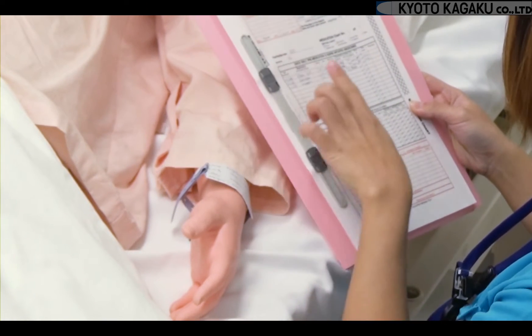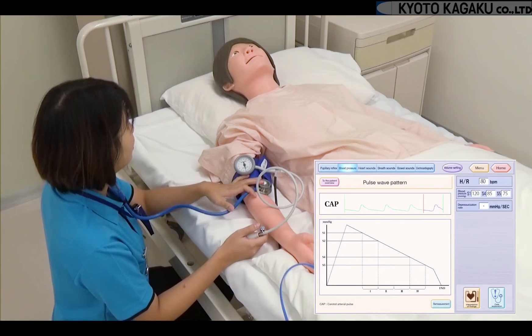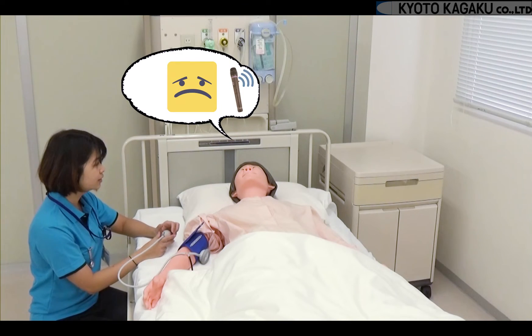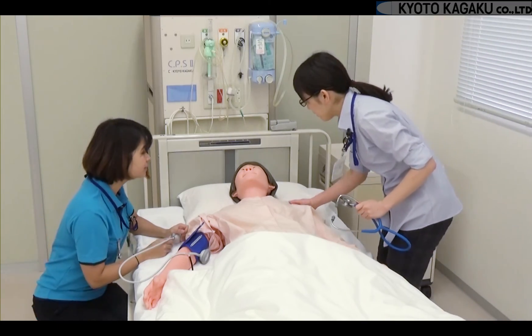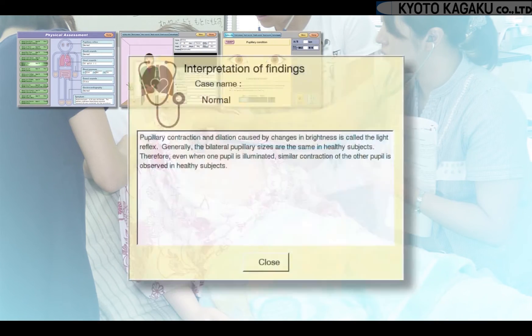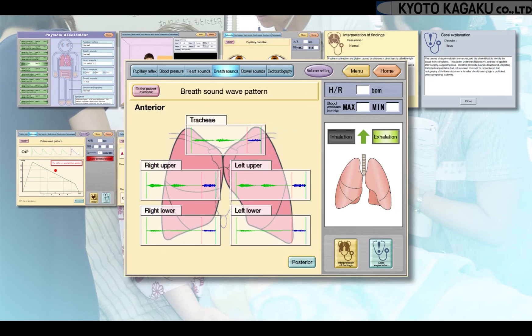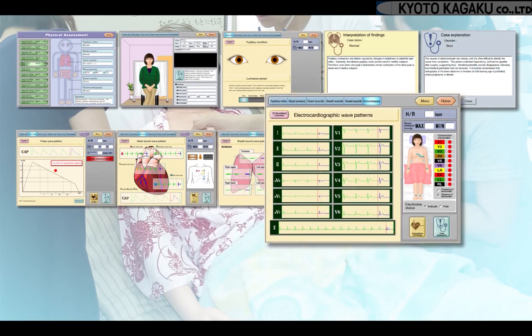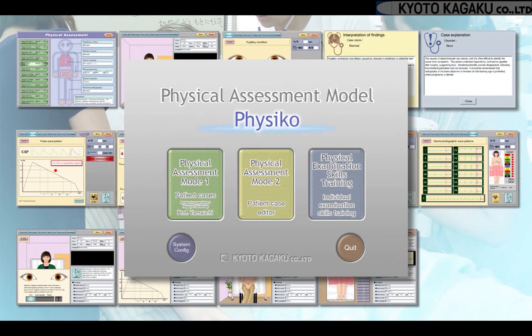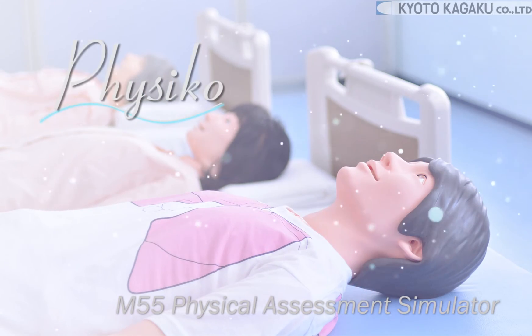Administer nitroglycerin sublingually and monitor every five minutes. If there is still pain, escalate the situation. The patient reports the pain is slightly better. This is just one example of the many cases Physico can re-enact — with 12 preset cases plus customizable cases, there are many learning opportunities. Thank you for being part of Physico's healthcare journey.